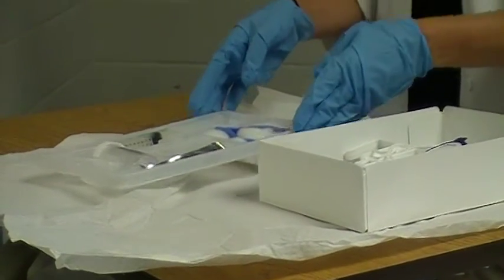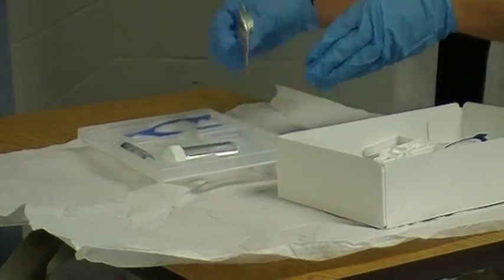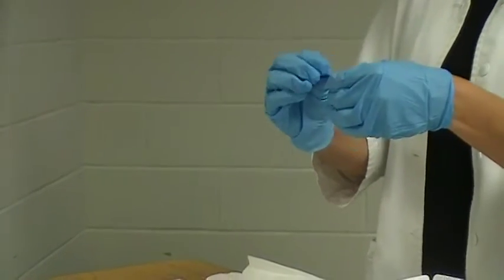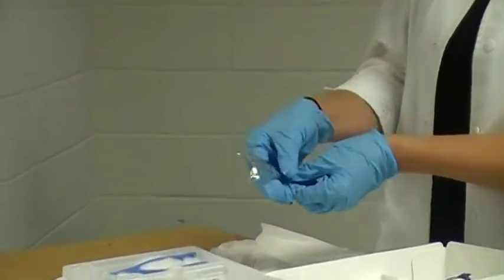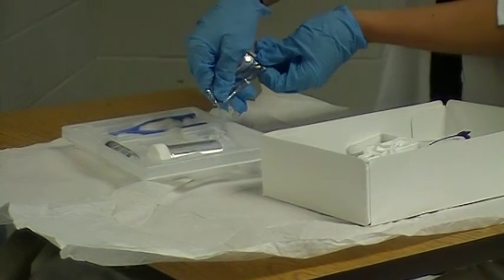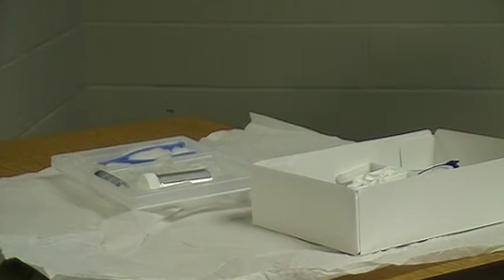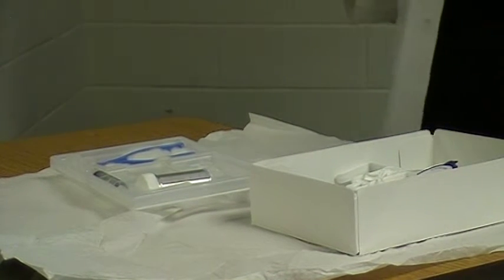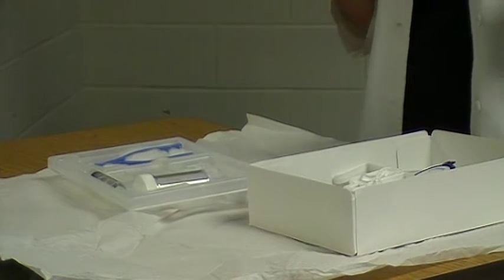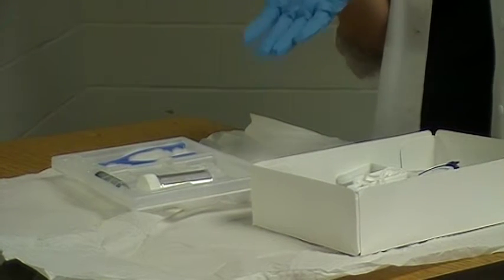Next, grab the lubricating jelly, open it, and squirt it out onto the tray — this lubricates the catheter tip. Drop the empty packet without breaking your sterile field. There is a cup in the kit; if the doctor ordered a sterile urine specimen you could use that, but we don't need it today. Then there is a syringe of normal saline with 10 mLs in it.